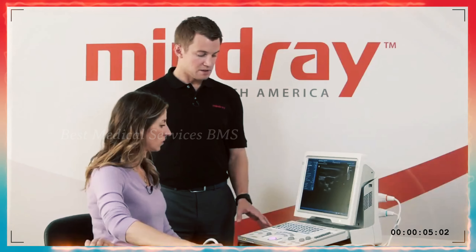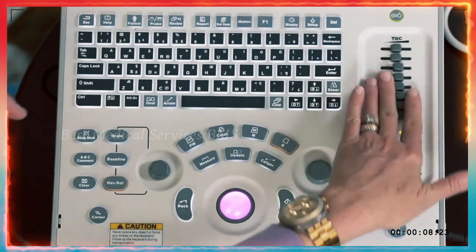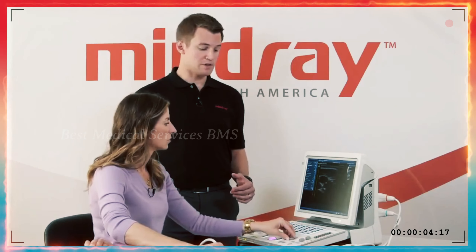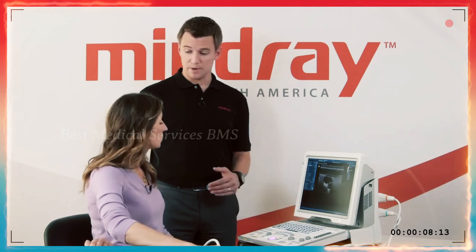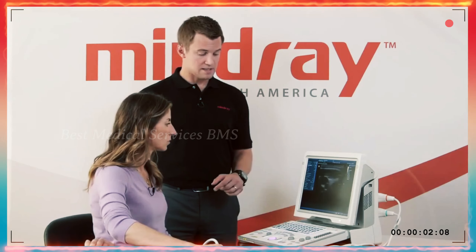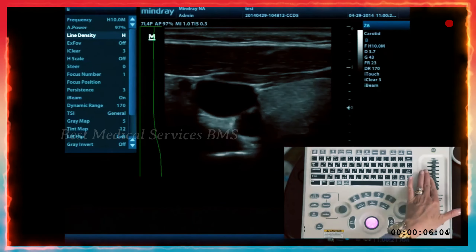The TGCs — time gain compensation — most users will leave those down the middle or slightly oblique from left to right. They control the brightness at one level of your image. The top TGC is at your skin level, and the bottom TGC is as deep as you are on the screen. You can slide those and play with them to control brightness just at each level of depth.